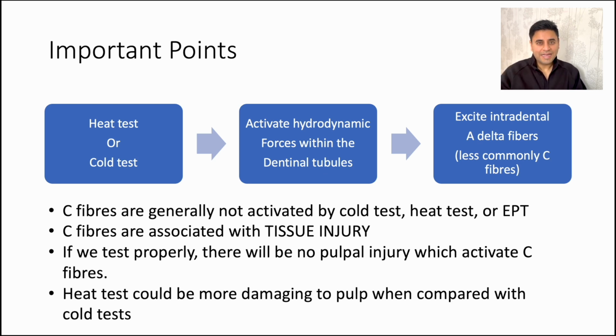And that's why indirectly we try to remember it in this way: do not perform heat test unnecessarily on a tooth if the patient's chief complaint is not pain or any symptom due to heat. If the patient's complaint is symptom due to cold, then just do the cold test and EPT, skip the heat test. Heat test is only when the patient's complaint is for heat. Otherwise, you are doing a little bit of damage to the inflamed pulp rather than fixing it.